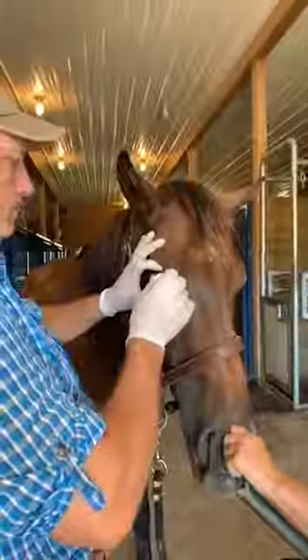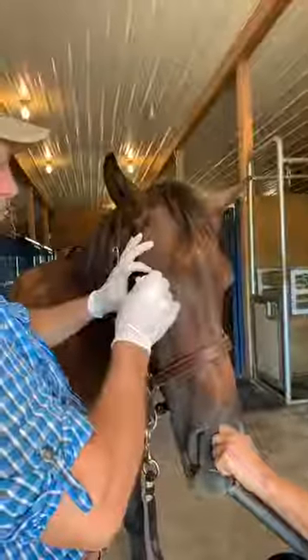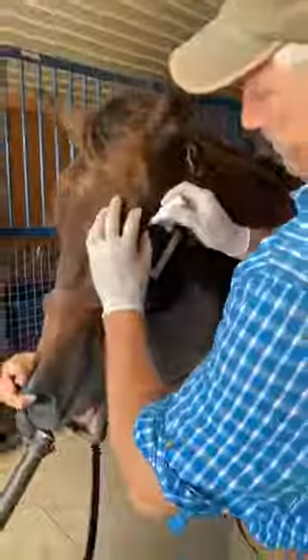Dr. Reiners, what do you typically use for the injection? Triamcinolone. Okay. Let's just put paracaine on here first. Paracaine will numb the eye and the conjunctiva where we're going to actually insert the needle. So it's just an eye drop, the same thing you get done at the eye doctor.